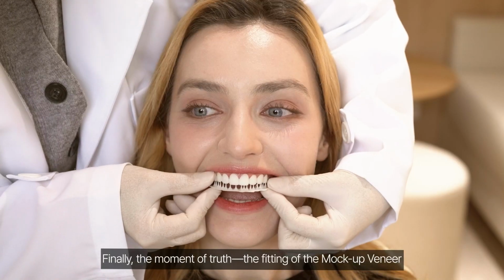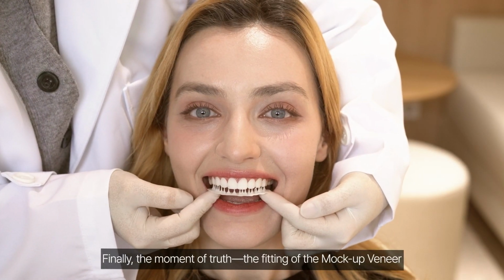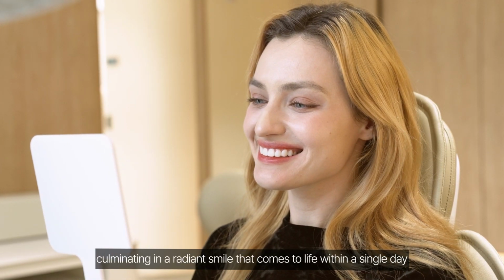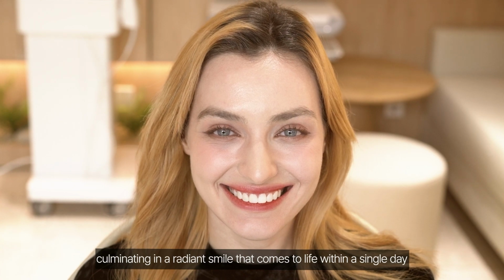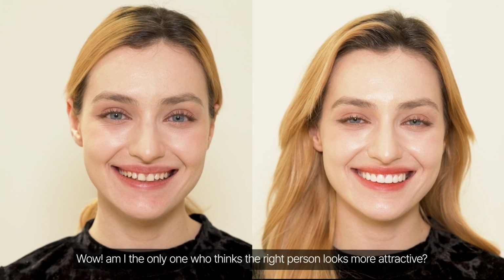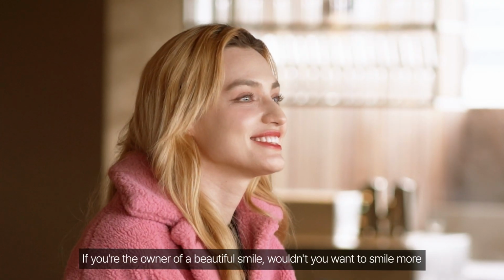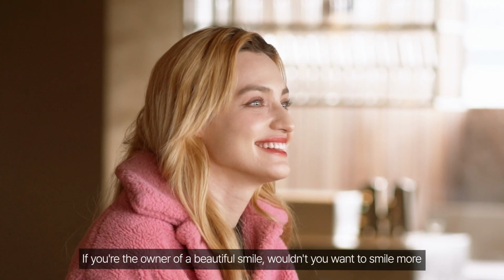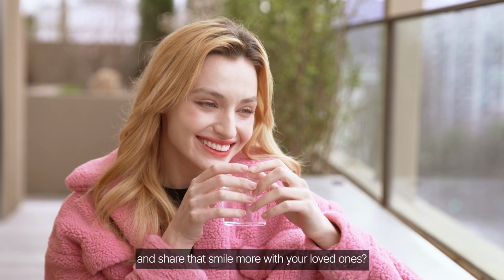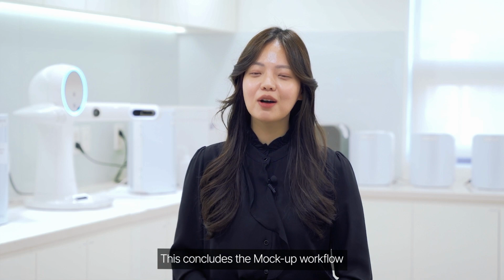Finally, the moment of truth, the fitting of the mockup veneer, culminating in a radiant smile that comes to life within a single day. Wow! Am I the only one who thinks the right person looks more attractive? If you're the owner of a beautiful smile, wouldn't you want to smile more and share the smile more with your loved ones? This concludes the mockup workflow.